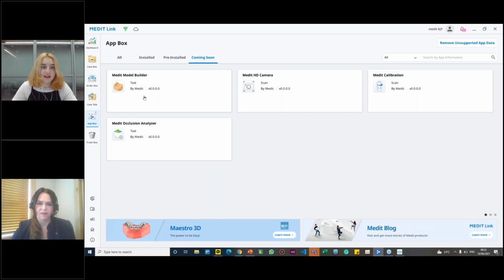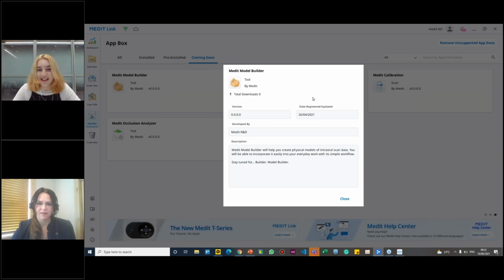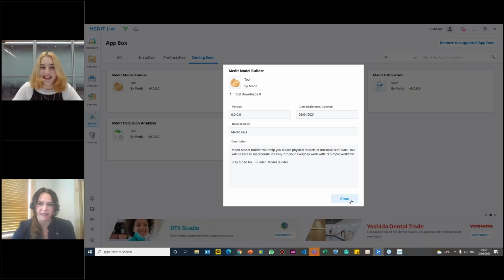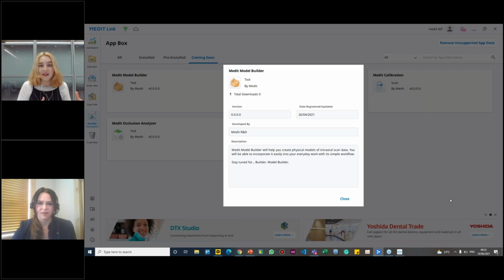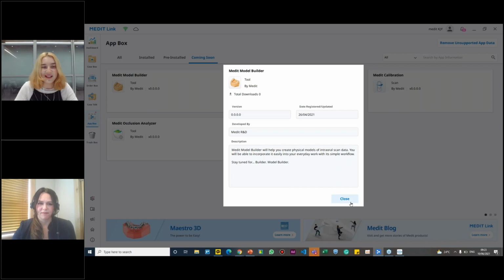And I think that this summer you will enjoy our Medit Model Builder, which is coming in July, I think the middle of July. Yeah. You did a demonstration for me, and it's pretty cool. You guys have got some good stuff coming down the pipeline, so I'm excited for everyone else to see it. Yeah, one thing I can say is that it's really simple. You've never had a simpler workflow when it comes to building a model, and hopefully everybody can enjoy it. And as usual, it's free for anybody who has a Medit Link account. So yeah, I'm very excited as well.